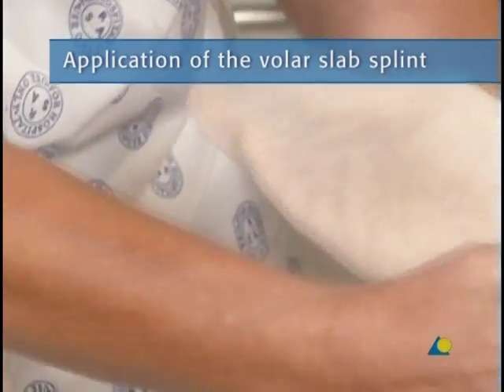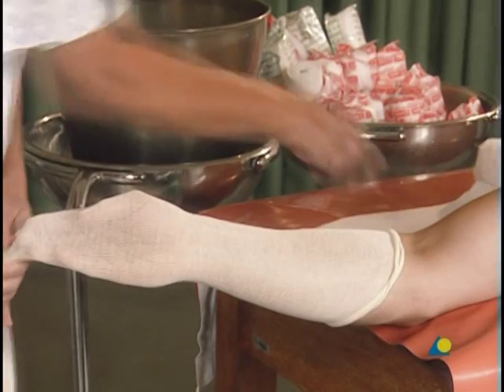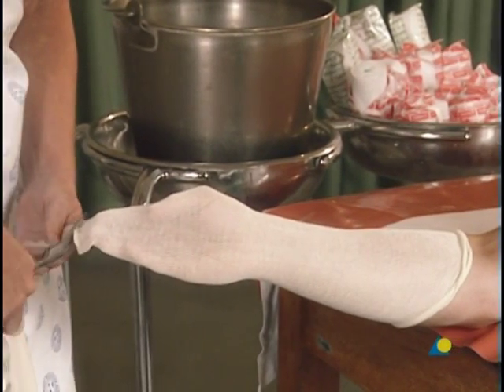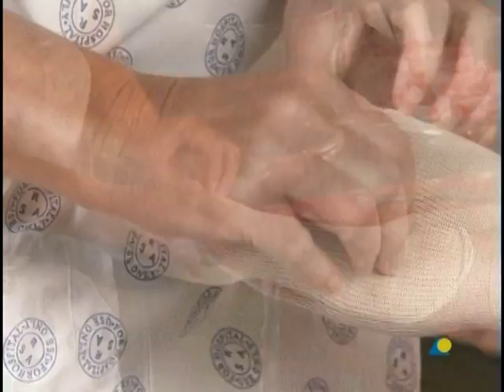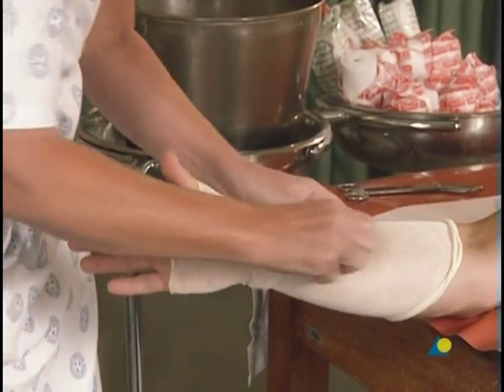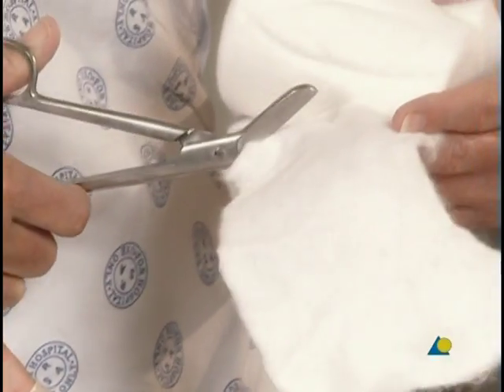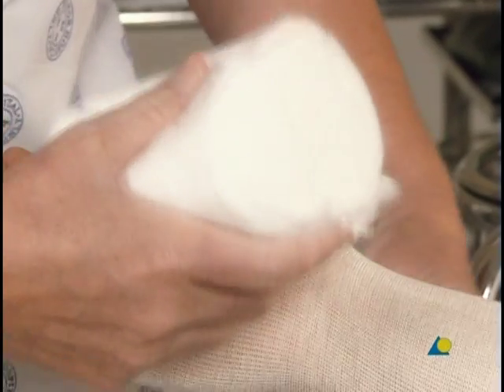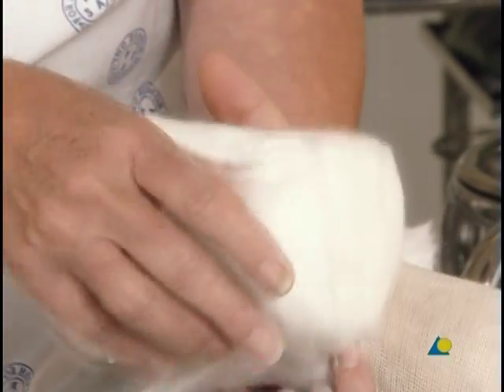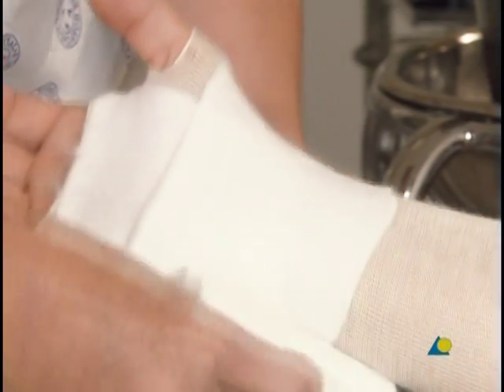To begin, a stockinette is applied and cut slightly longer than the final cast will be. A small opening is cut for the thumb. A slit is cut in the cotton wool to go through the first web space. The cotton wool is gently wound on, giving an overlap of 50%.